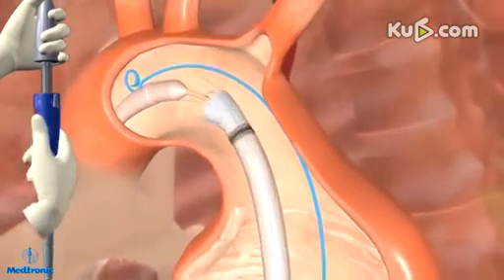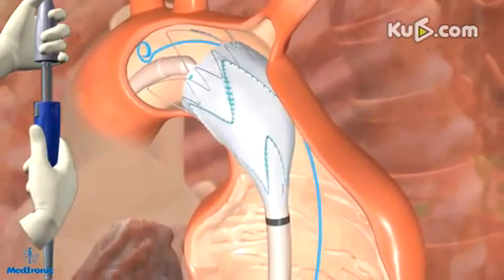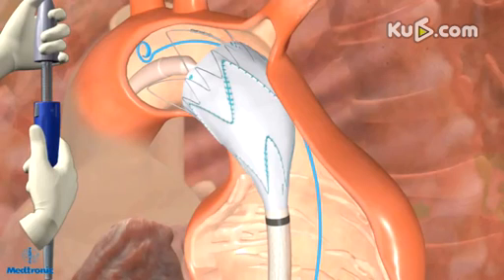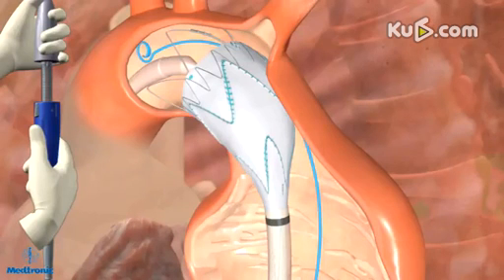Deploy the proximal end of the Talent Thoracic StentGraft by holding the delivery system stationary with one hand on the front of the handle and slowly withdrawing the graft cover with the other hand by rotating the external slider counterclockwise. Withdraw the graft cover until the proximal bare spring and the next covered spring have been deployed, making sure that only the first two springs are deployed before verifying the position. Perform angiography to verify the position of the stent graft in relation to the desired location.